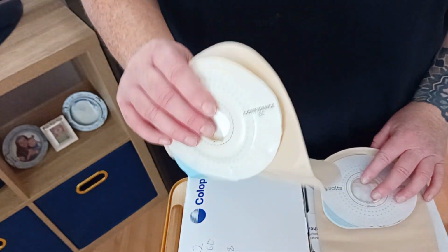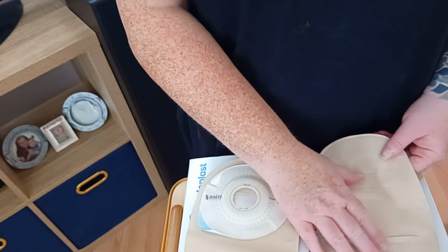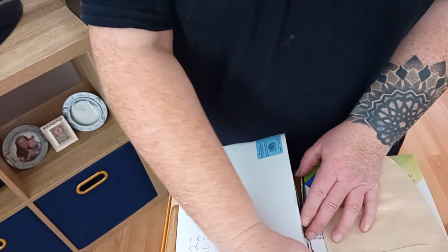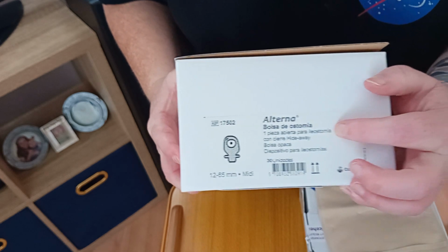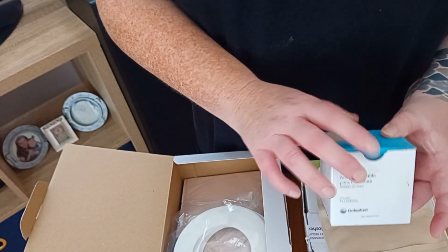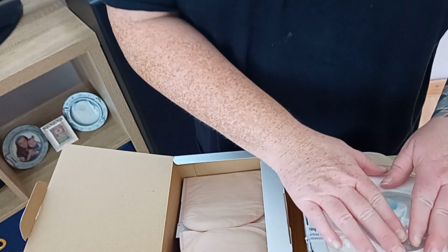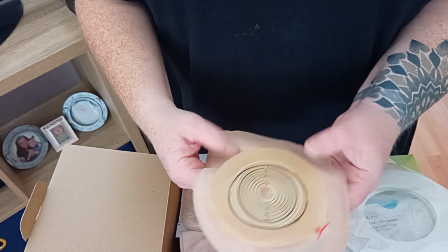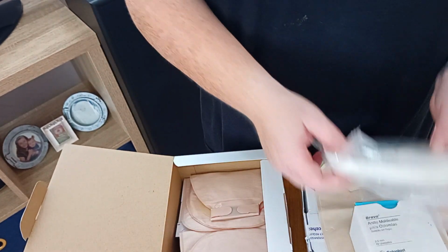So there's different bags. Obviously, there's the one with the dish. This is my bag. Salts bags. They're fantastic. You can get them in skin colour and black. I went on holiday last year and I forgot to bring my stuff. So I actually had to go and buy bags that are for ileostomies, but they're weird. The seals were £17 for 10, but these seals had to be stretched to fit. This is some sort of seal for the bag, which is white, and this is the bag. It's like a shopping bag. It's like a Tesco bag. It's rubbish. It's crap. But anyway, I'll show you my setup.